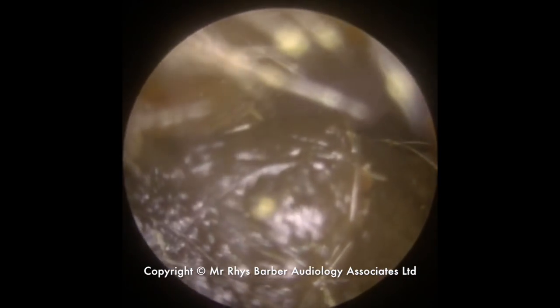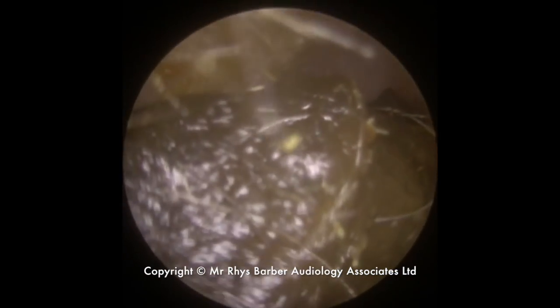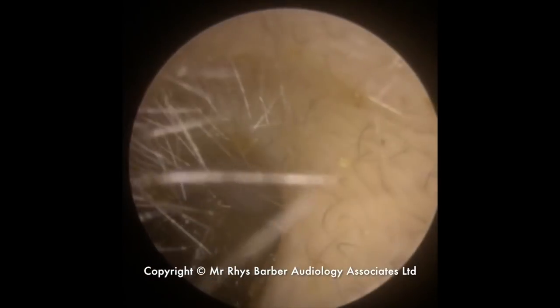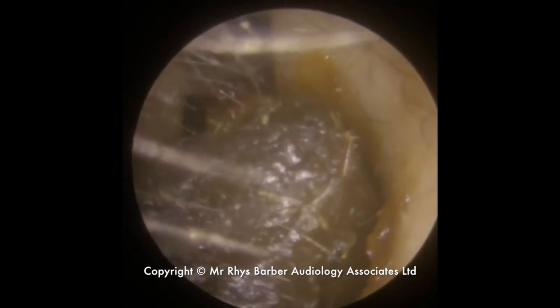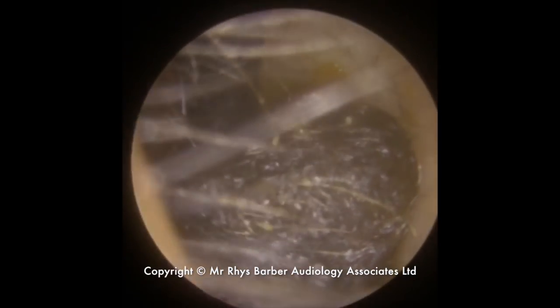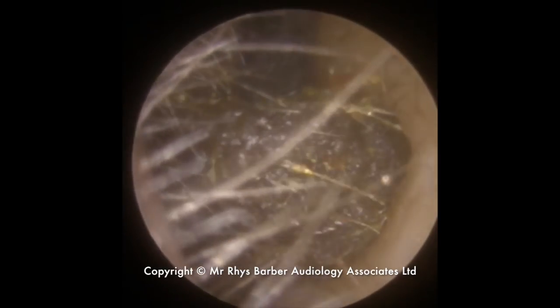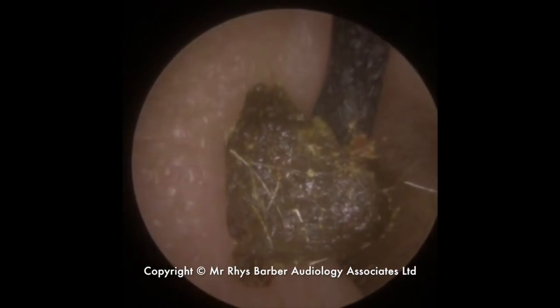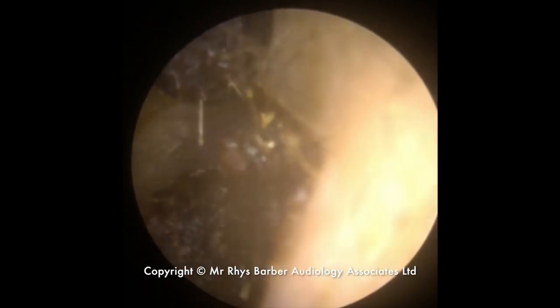You can see this gentleman has got some quite sticky wax — not completely blocking the ear canal, but just causing a few issues with hearing. Using the Jobson horn, you can see a little bit of wax on it because I've used it just to probe the wax first of all, just to see how sticky it is. The reason we're opting for the Jobson horn rather than the Zollner tube is because the wax is so sticky in nature.